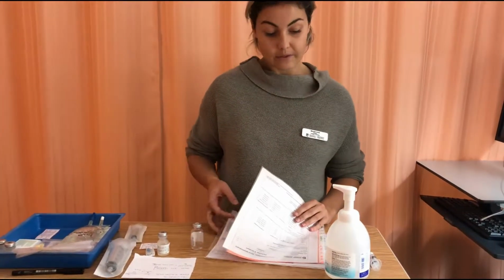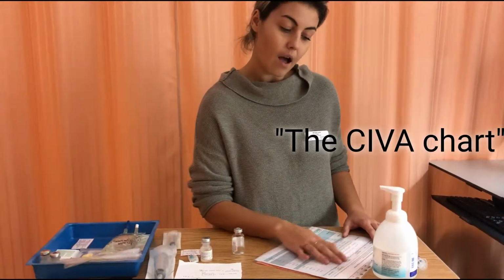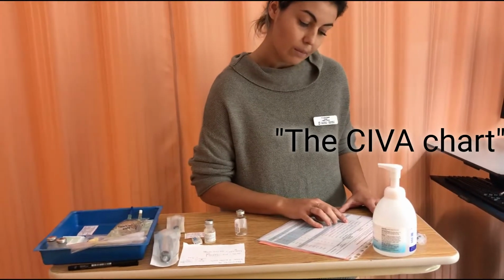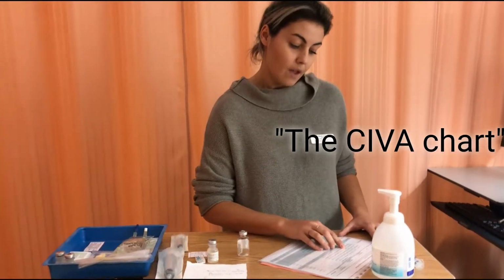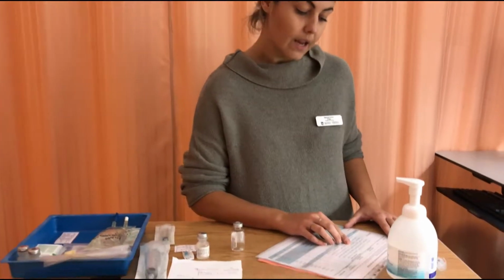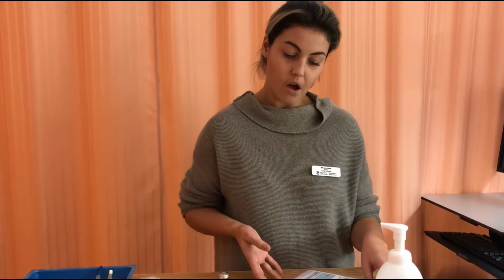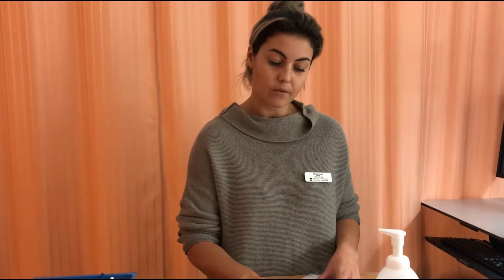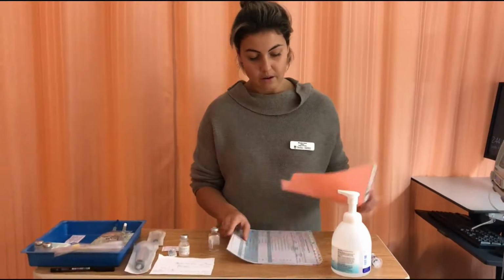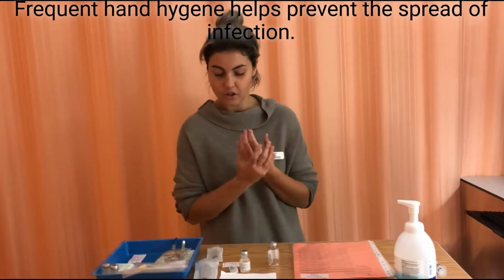And for the CIVA, I'm going to look at the CIVA pump infuser administration record. And for 3 million units, I'm going to be putting 30 mLs in a 30 milliliter syringe on the normal rate, and it's going to be infused over 35 minutes. All right, so perform hand hygiene.